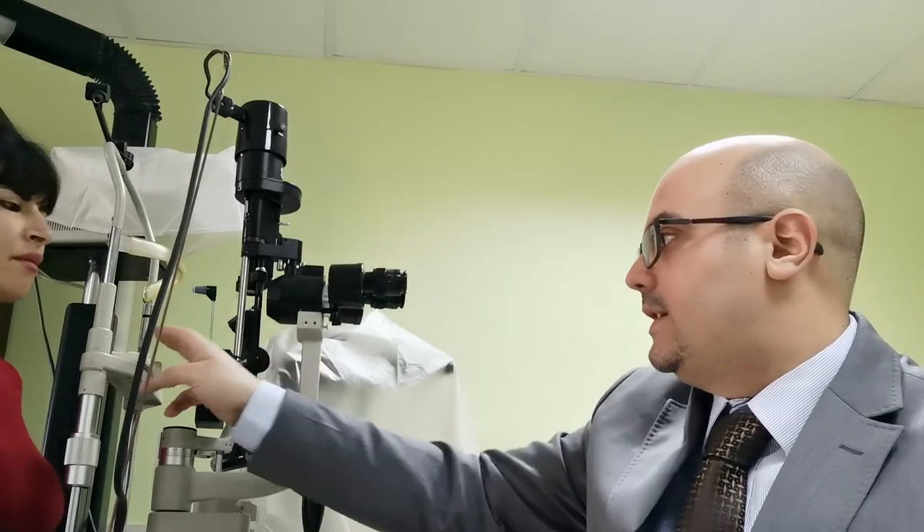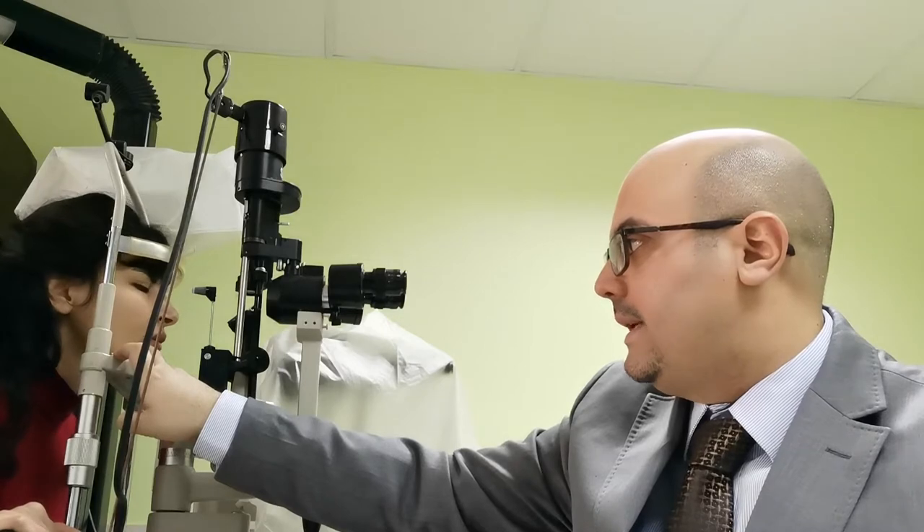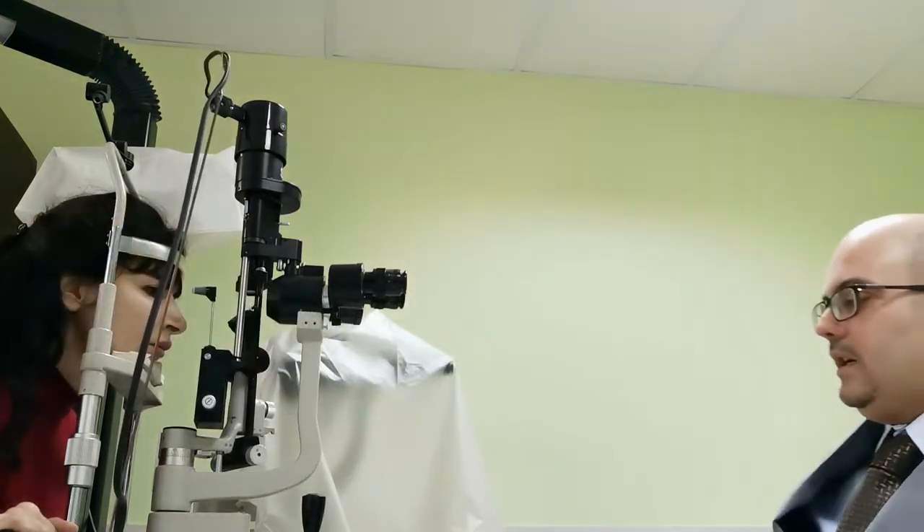Now we will demonstrate how to take the intraocular pressure. The first thing to do is ask the patient to put her chin on the plastic shell and force her head forward.